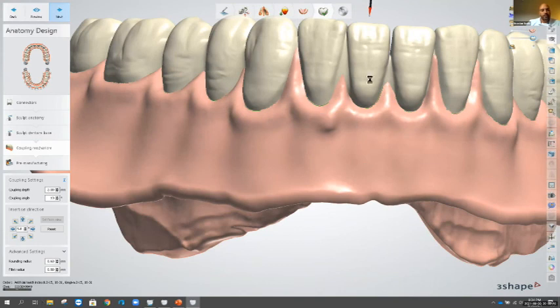Fill that in and then go over it with clear acrylic, and that will capture that material in there. So I'm just going to go next through these steps. The very last step after these two steps is just the saving and closing out and then generating the cam.